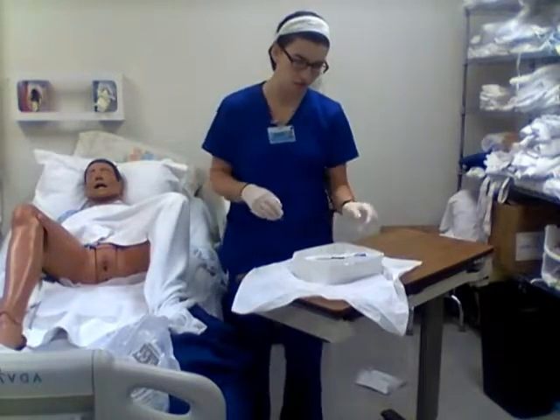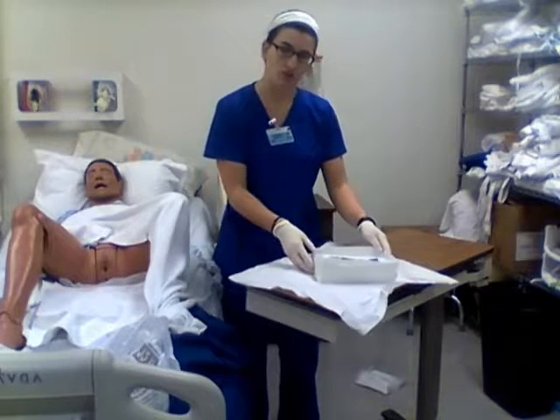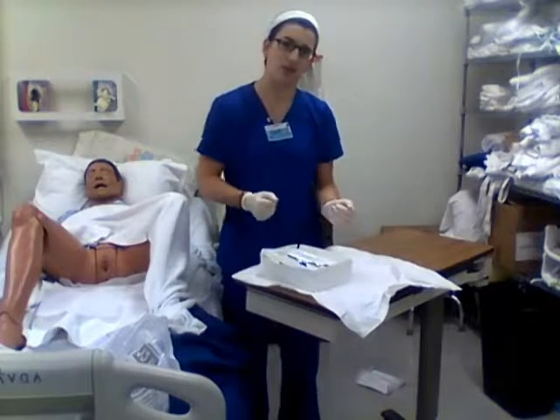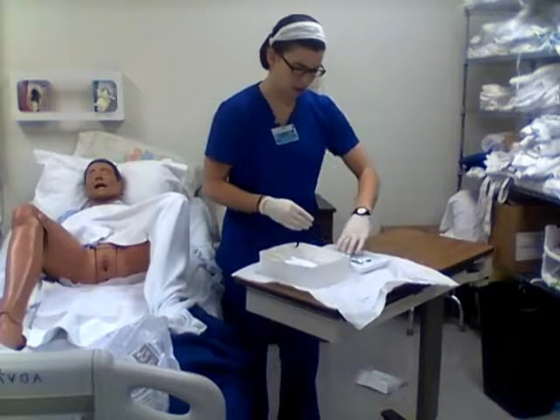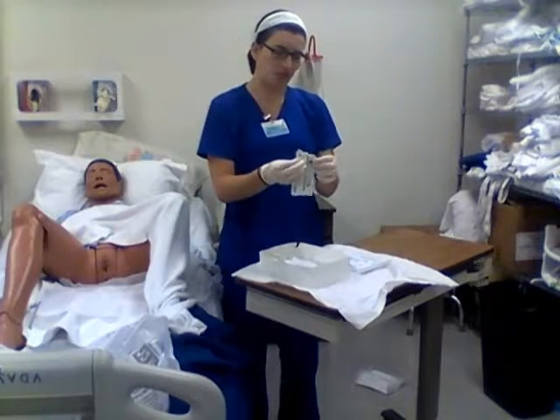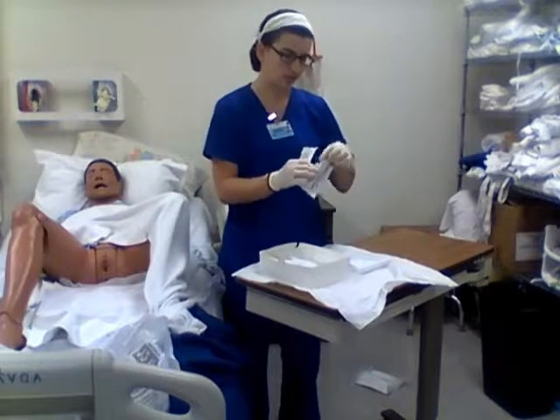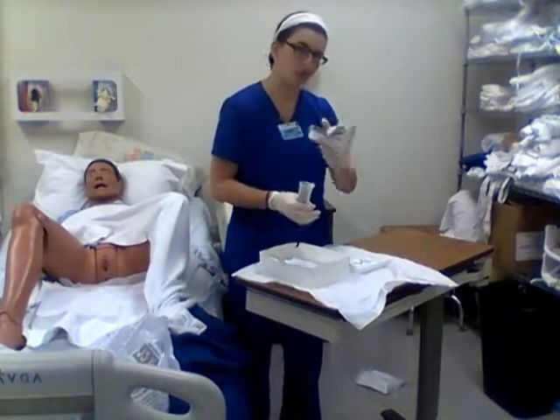So now we can go ahead, we can get our supplies ready. This is all sterile and I've maintained sterility. So I can go ahead, I can rearrange this to make it more comfortable to work for me, as long as I stay within that outer 1-inch border. So I can go ahead. I have my little cotton swabs. I can rip those open, and I can dump them out on my tray and throw these away.